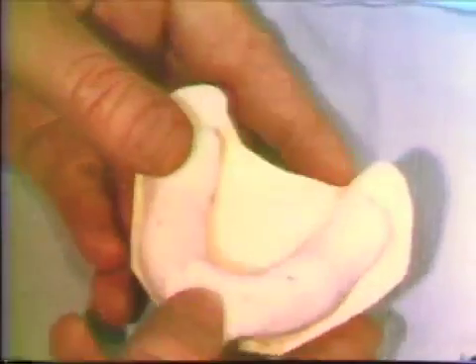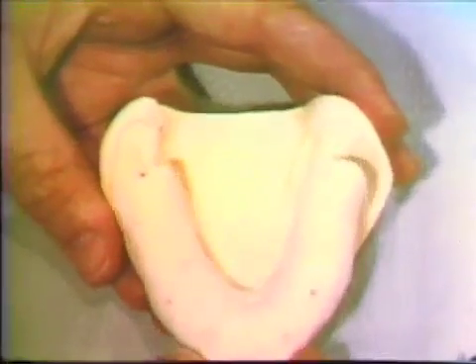A full arch recording is necessary for surveying procedures during the forming of the wax crown pattern. The custom tray is tried in the mouth and adjusted for proper fit, support, and extension. The gingival retraction material is removed. The preparations are air dried and the impression material injected onto and around the prepared tooth. The tray with its contained material is then seated over this mass. A light consistency rubber material is used for the injection procedure and heavy-bodied rubber material for the tray.